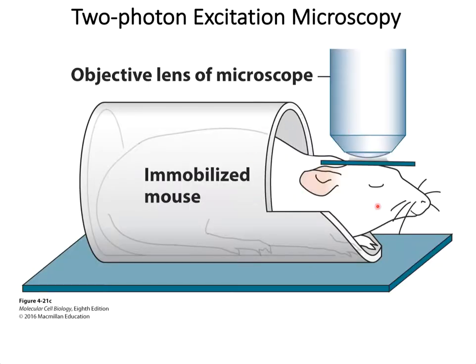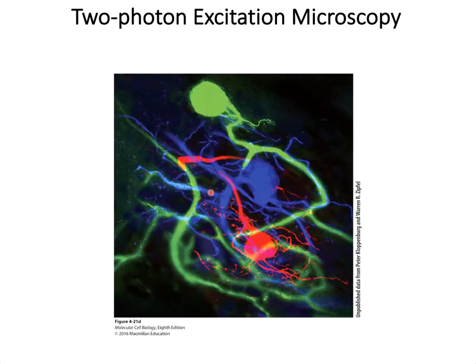So two-photon microscopy can be used to observe cells up to 1 millimeter deep within a living animal. This is known as intravital imaging because it does not excite the fluorochromes outside the plane of focus. It is often used in live brain imaging, as you can see in the test animal. Here you can see the nervous tissue in an intravital imaging of labeled neurons in a lobster.